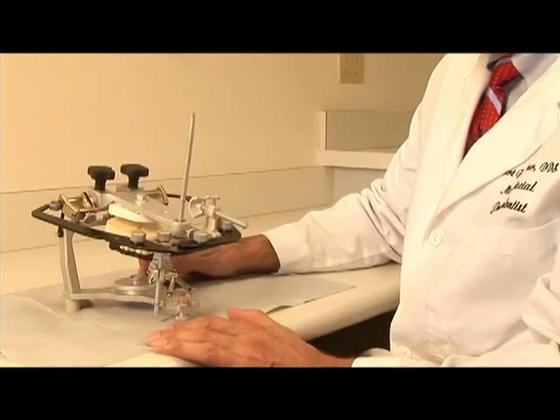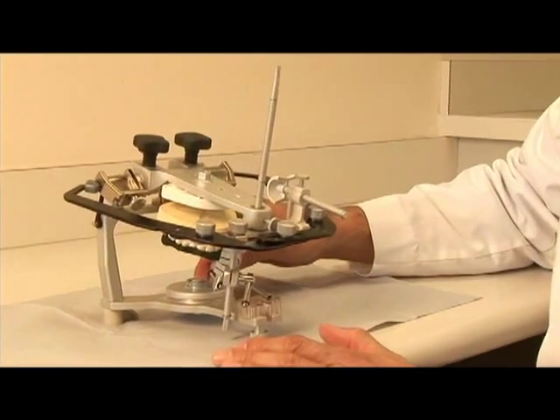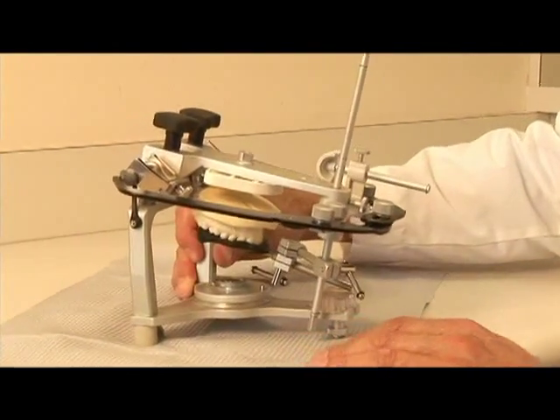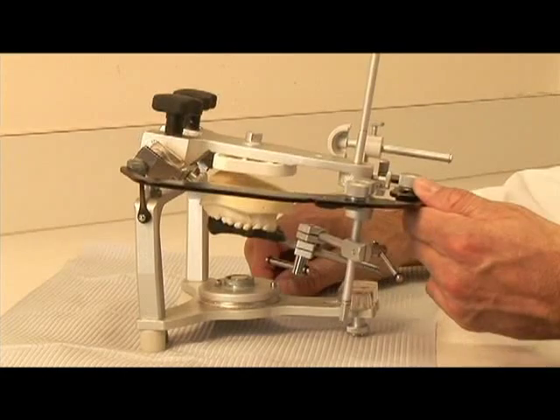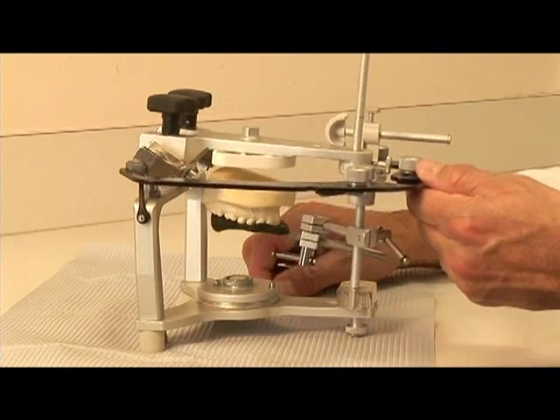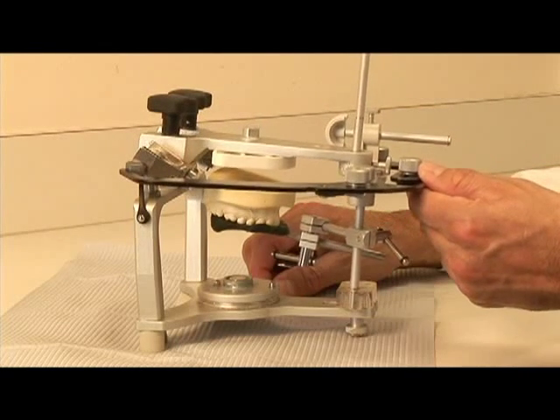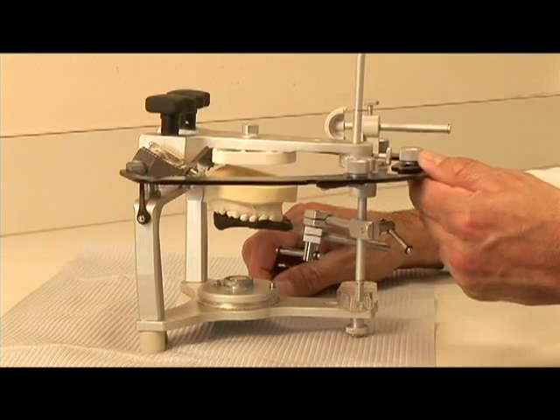One additional note, the relationship of the maxillary cast to the maxillary member of the articulator with the face bow in place will not change during the mounting regardless of the angle, because this has been preset so that the axis orbital plane can be maintained through the entire mounting process of the maxillary cast.